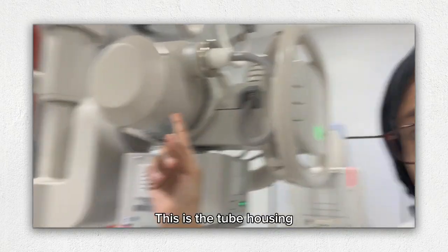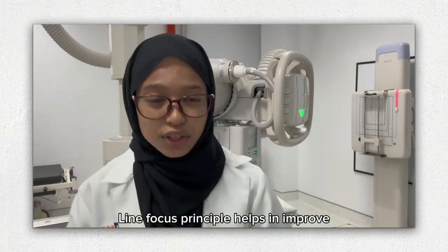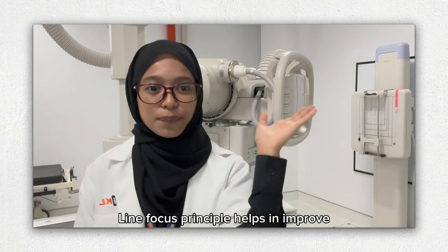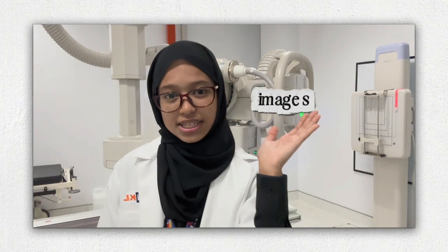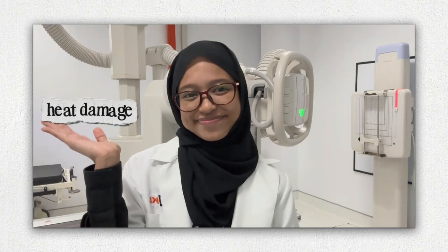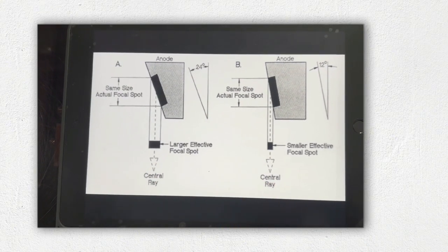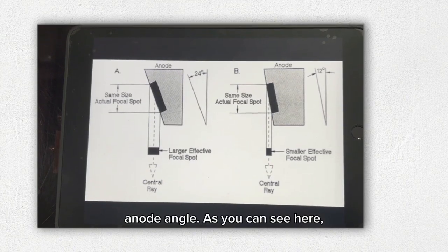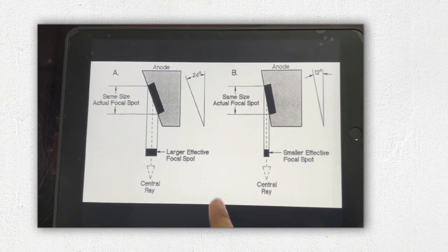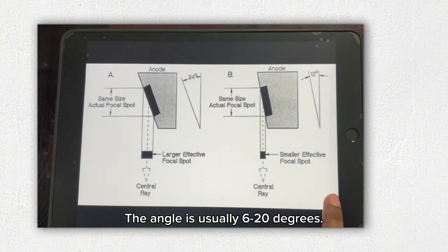This is the tube housing, also called the X-ray tube. The line focus principle helps improve image sharpness and prevent heat damage. This is an example of two different angles. As you can see here, the anode is angled. The angle is usually 6 to 20 degrees.